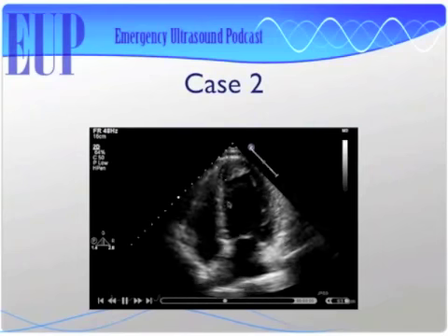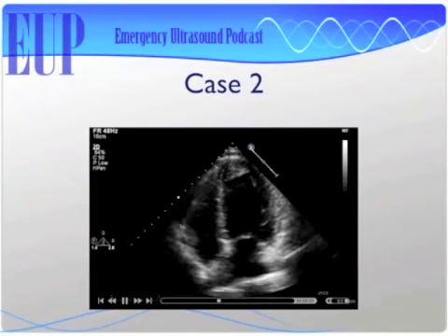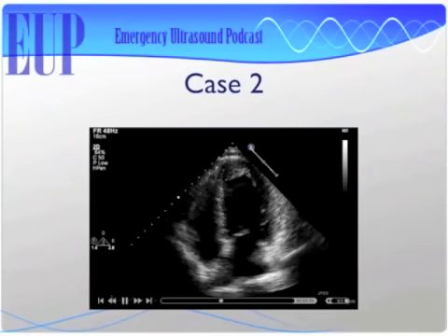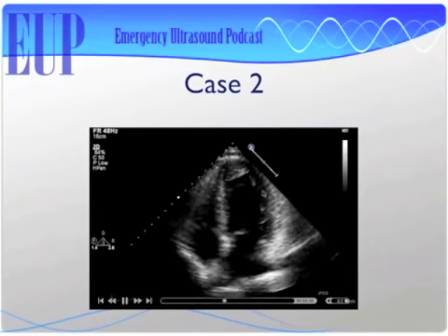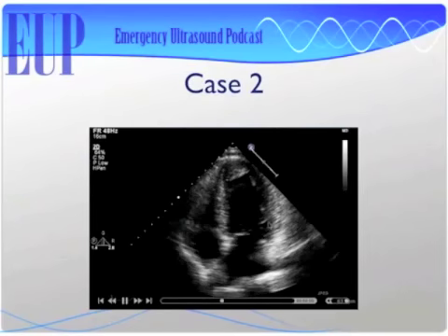It's still squeezing, but it's getting lazier. Laziness. And up in here, what do we think about the squeezing of that? Sucky. Okay. And then down over on this side, what do we think about this stuff over here? Not great and better. Not great and then better. Okay. All right. I like what we were thinking.